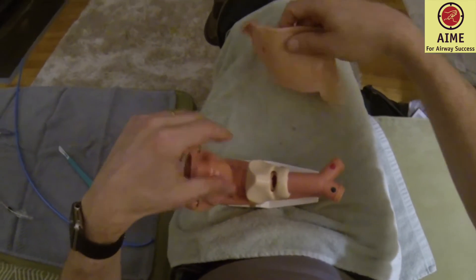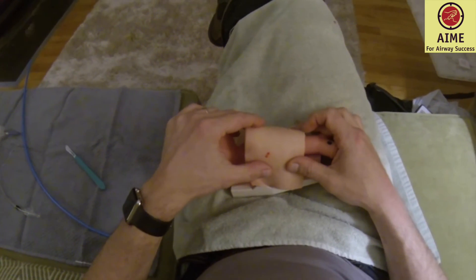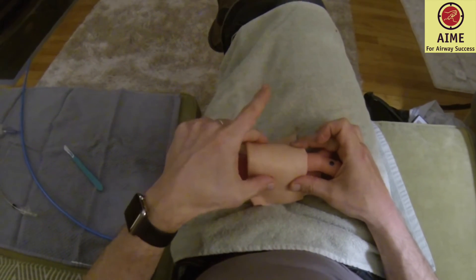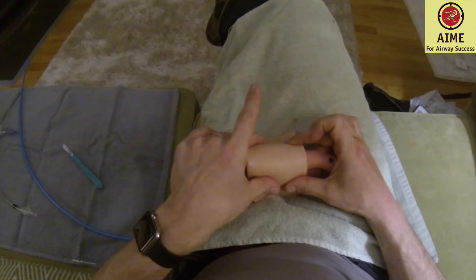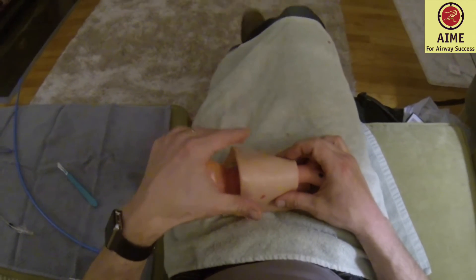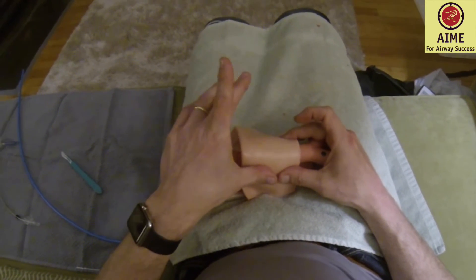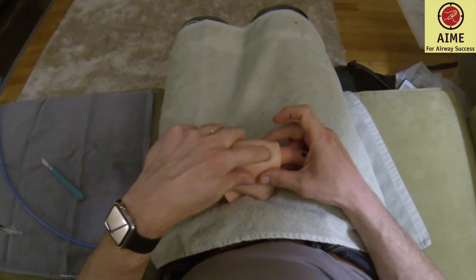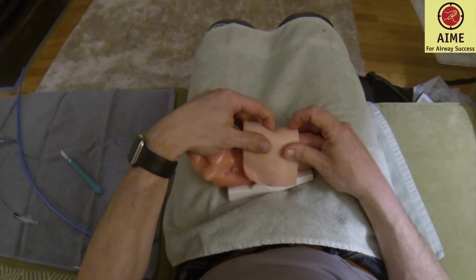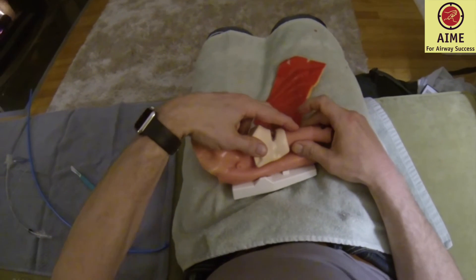Let's go over techniques. Landmarking is tough — it's been shown repeatedly that we're not very good at it. You should always begin with what Rich Levitin refers to as the laryngeal handshake: your thumb and middle finger stabilizing the cartilage, because it's very mobile in a relaxed patient — unlike in you and me right now, or in mannequin models. You need to stabilize with thumb and middle finger, and your index finger is trying to roughly find where the cricothyroid membrane is — follow up from the sternal notch, feel the cricoid cartilage, then fall into the cricothyroid membrane, or come down from the thyroid cartilage into it.